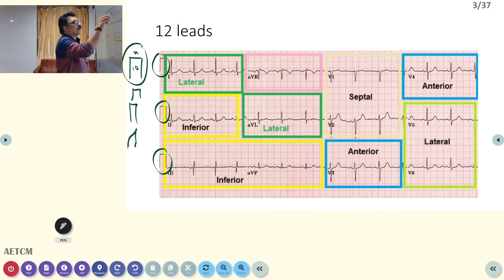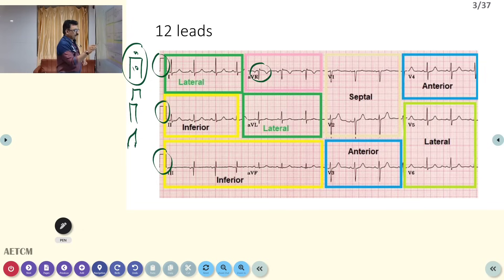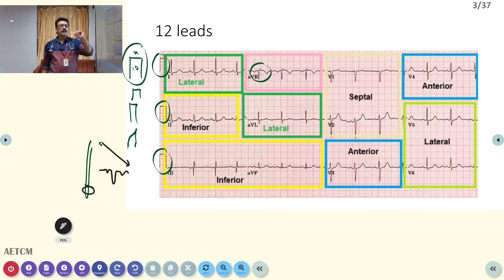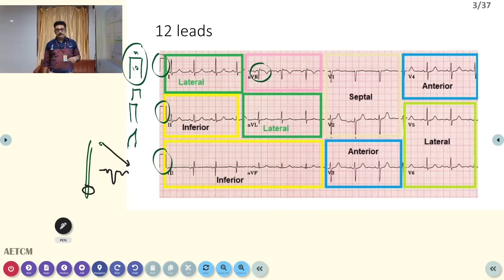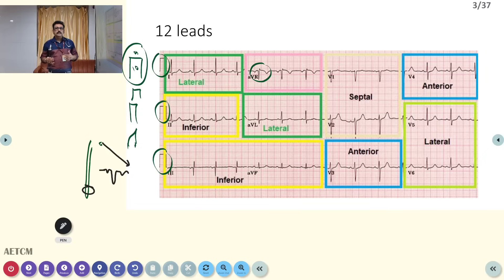The next thing to check is AVR. All complexes in AVR have to be negative, because we are connecting that lead on the right side and the electrical activity is always going away from this vector. So all complexes in AVR will be negative. Two important things: one is standardization, and second is AVR — every complex in AVR has to be negative for a normally taken ECG.